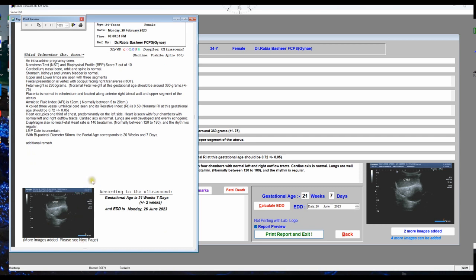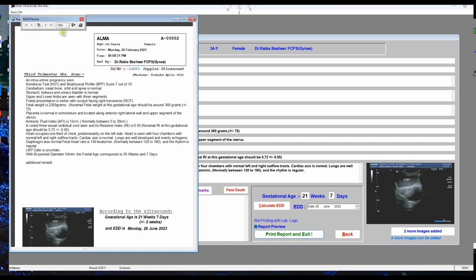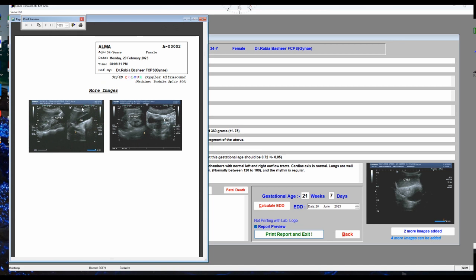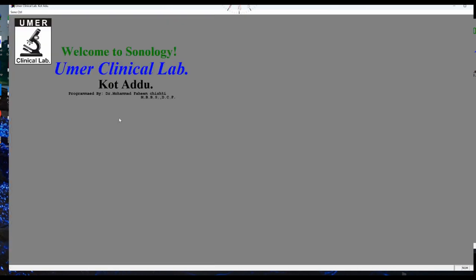The report also shows the gestational age and EDD according to the ultrasound, and the images are displayed. If you click to the next page, additional images are shown there as well. A two-page printout will be handed over to the patient. The method for first, second, and third trimester obstetric reports is the same.